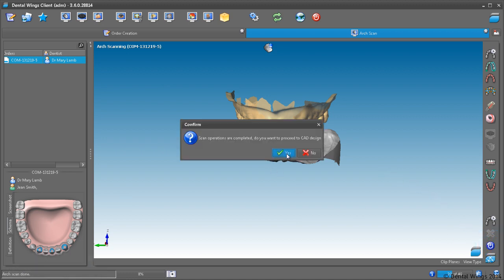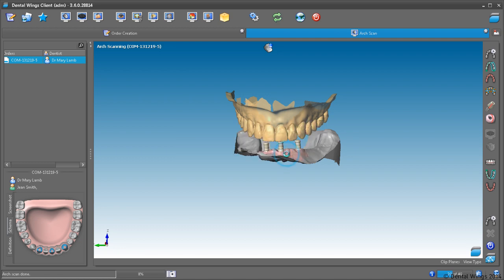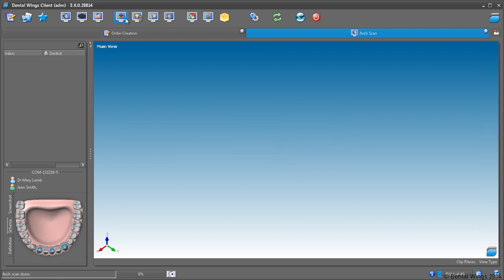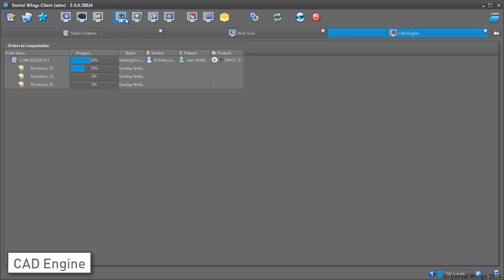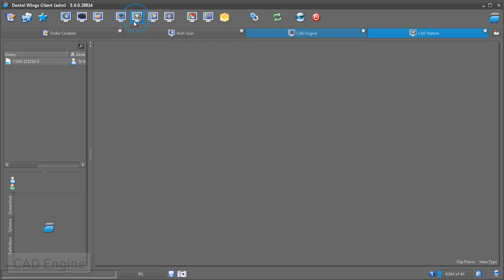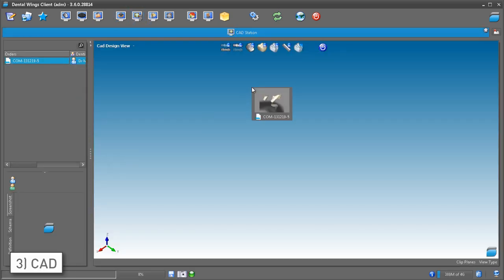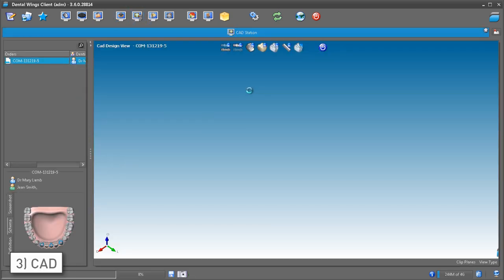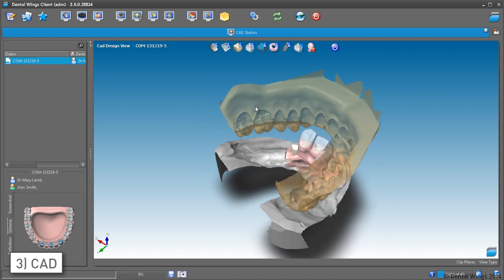Now that the scans are completed, exit the scan session and process through the CAD engine. Once you open the CAD station, what's computed is a virtual wax-up with gingiva for the abutments and the pontics between them.